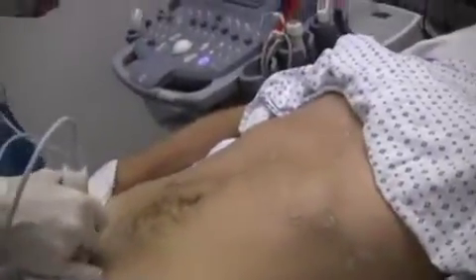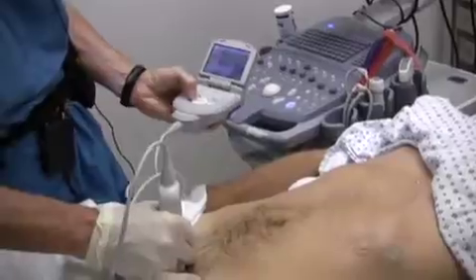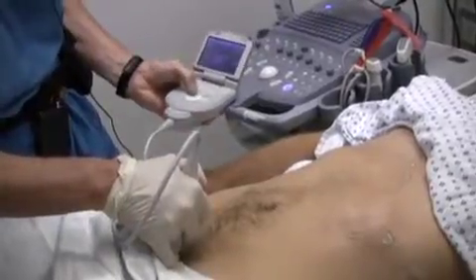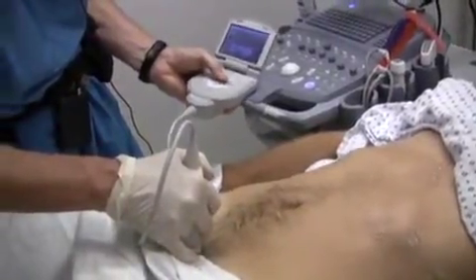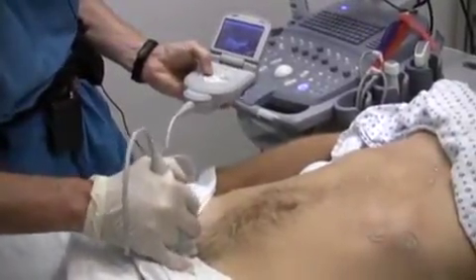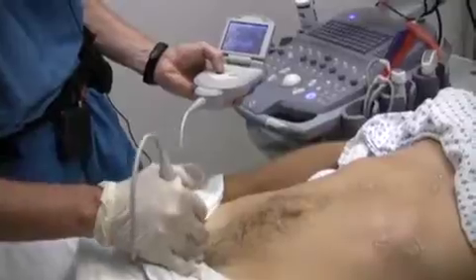Suprapubic view, transverse. Go down to the pubis. We can see the bladder. We need to decrease our gain so that we don't overwhelm the retrovesical space with ultrasound and cause posterior acoustic enhancement gain artifact. Here we have the prostate just in view, then the seminal vesicles. Now we get up to the area most likely to find free fluid in the suprapubic evaluation and scan all the way through until the dome of the bladder. On this occasion, I don't think we're seeing any free fluid. The small amount of free fluid we saw in the previous image — I think it's resolved, and it's definitely a physiological volume.